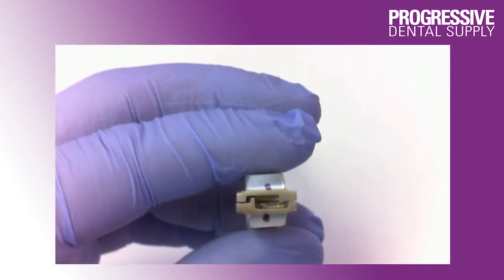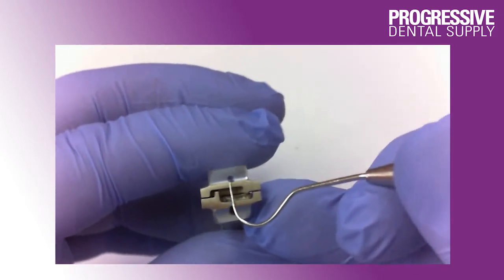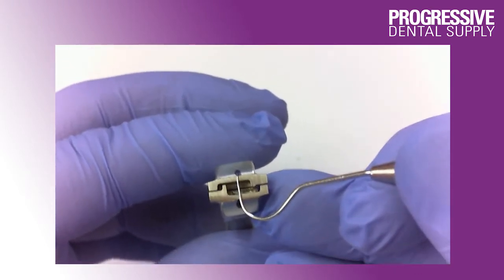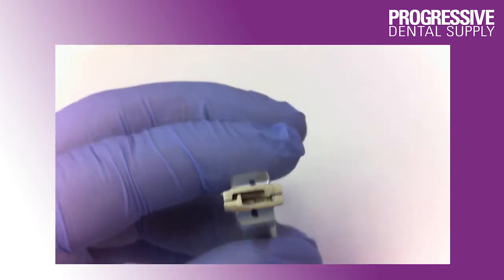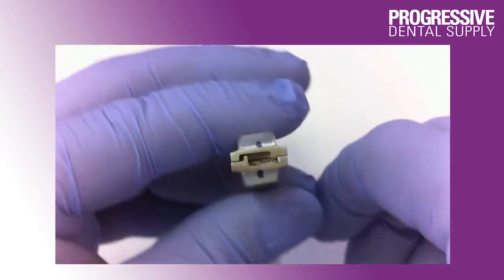Now let's take a look at the tip of the plier. The plier has a marking in the center, and this marking is there in order for you to be able to center the plier to the bracket, so the bend will end up centered with the bracket.